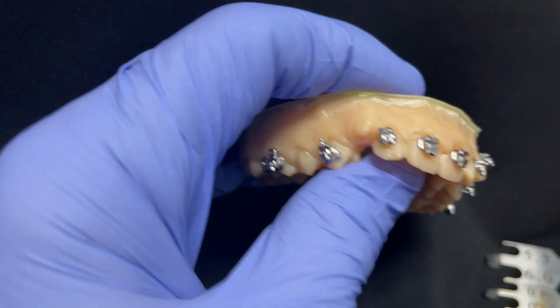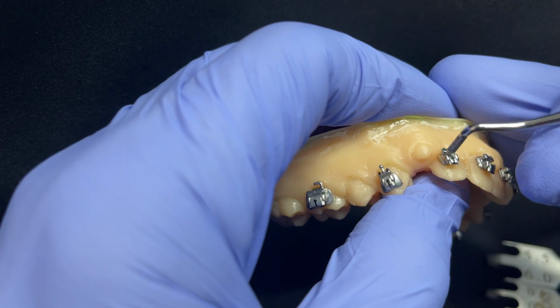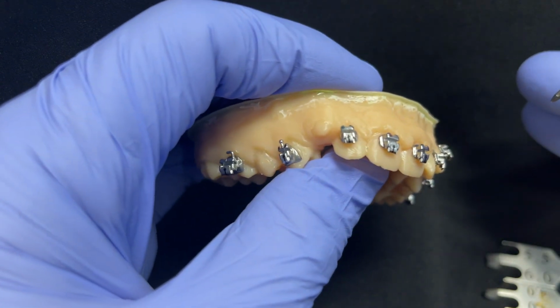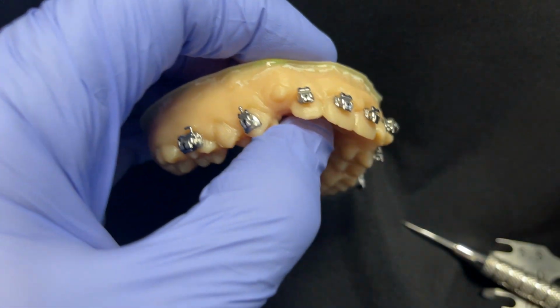And I think we got a little overboard on our tip here on our 2. So we adjusted that just a little bit. There we go. So that's better. And so I'm going to light cure and call it a day for this case.